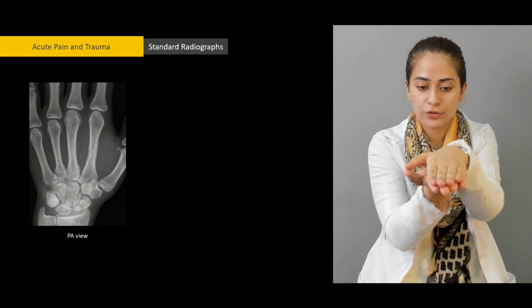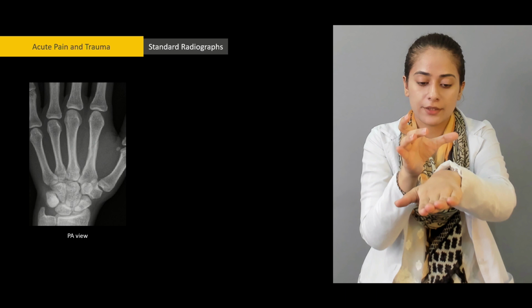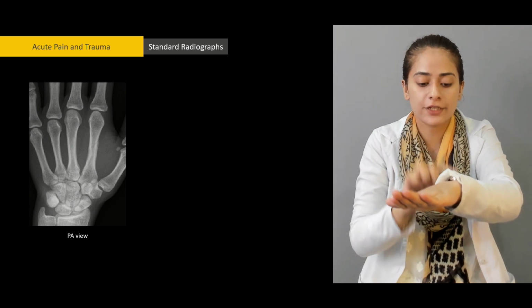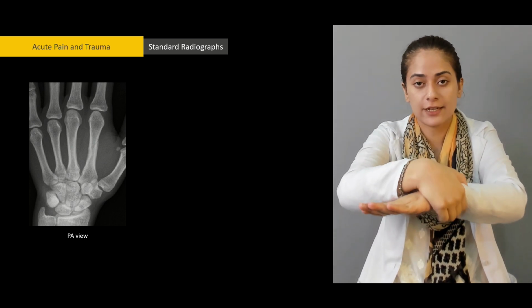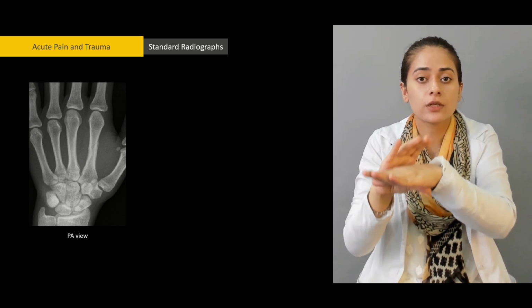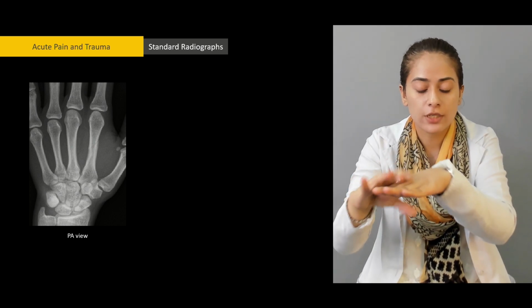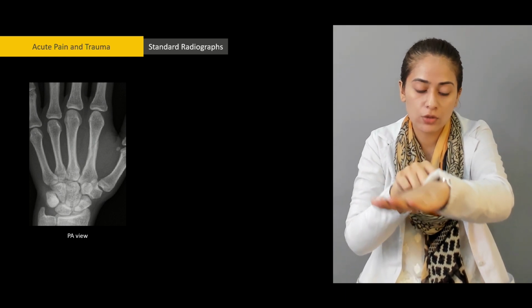So the picture that we're going to get is the focus for a radiograph of the wrist. So this is the radius bone, but this is the lateral bone, talking in anatomical position. So this is actually the medial bone, which is opposite in this case because my hand is prone. When we refer to bones in anatomical position, supination of the hand is the anatomical position. So when my hand is in pronation and it is being x-rayed, we will call this bone the lateral bone and this is the medial bone.